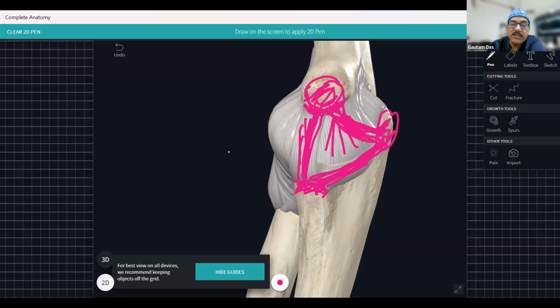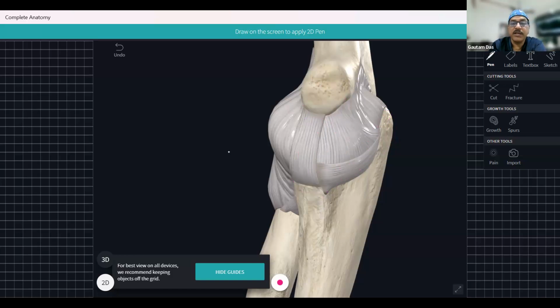Though some literature tells that the inferior band is almost invisible and difficult to see, we can still see the inferior band also. It's not seen in all the volunteers, but it will be seen in many volunteers here today. So we have scanned, and I'll be demonstrating the inferior band as well. The anterior and posterior bands are easy. The difficulty is the inferior band, but somehow we'll be able to show you that band as well.